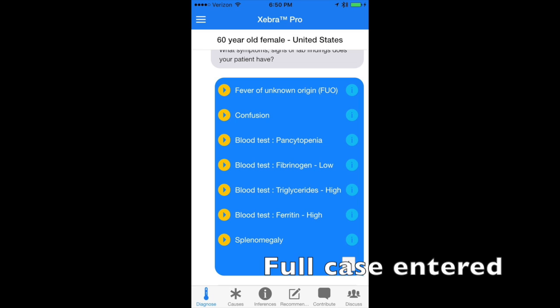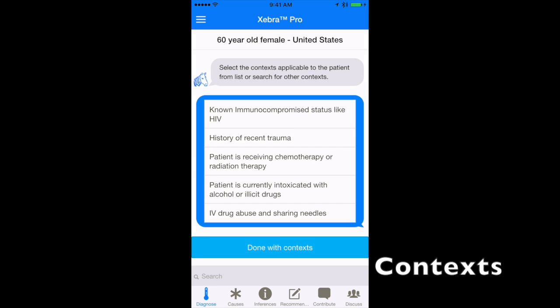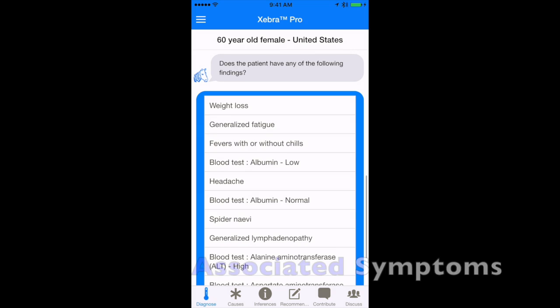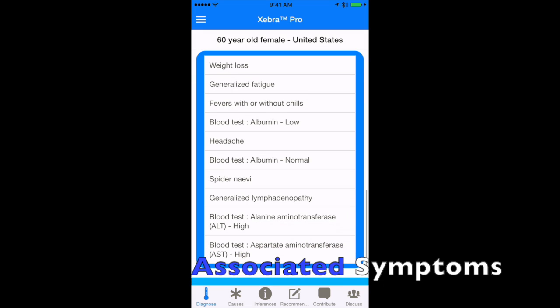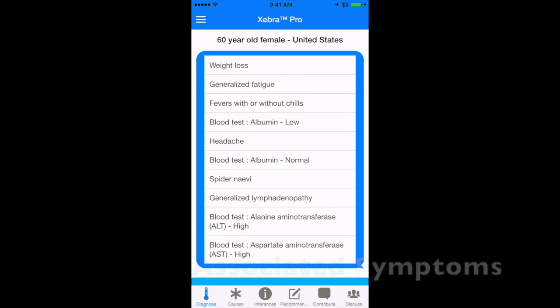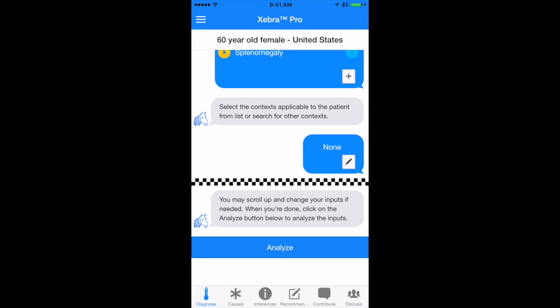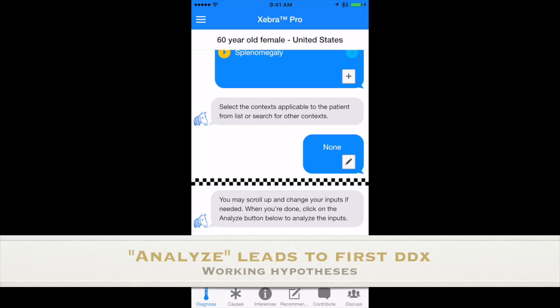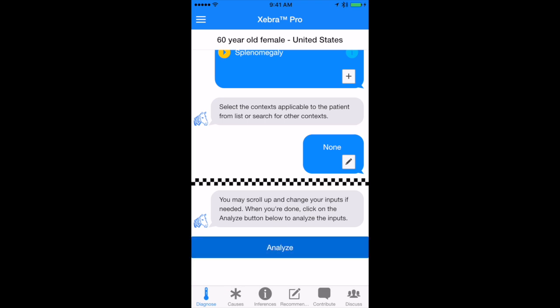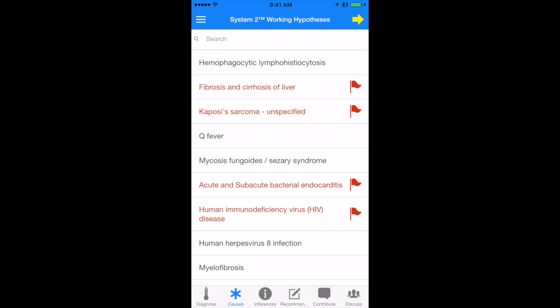Let's enter the entire case and then you'll see that context are presented by the system as well as associated symptoms. Let's select no for additional symptoms and then press analyze. There's your differential.